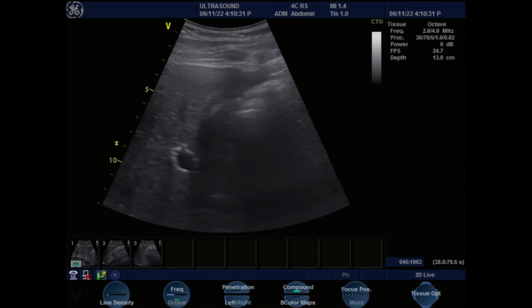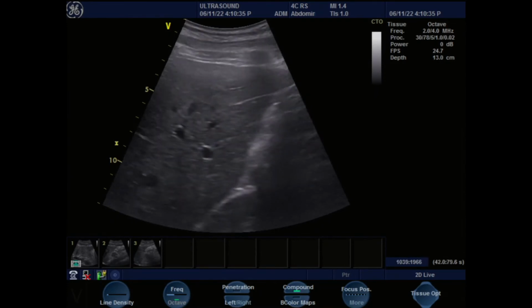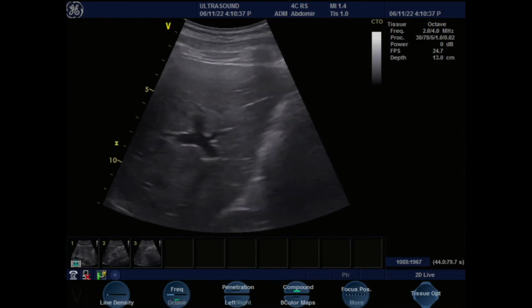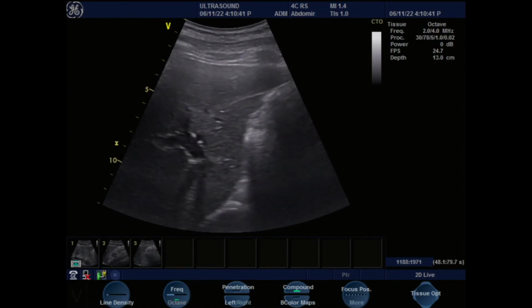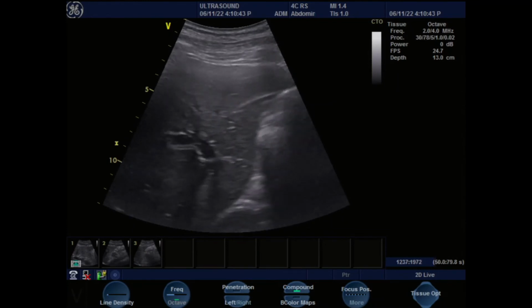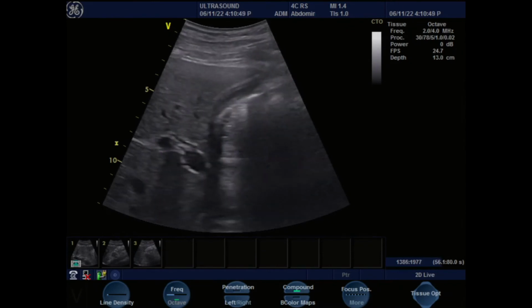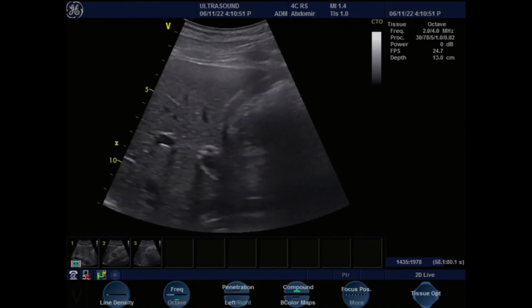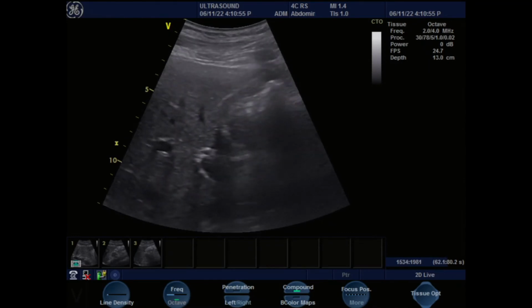Turn sagittal. We have to take sagittal and transverse images, but the probe doesn't have to be sagittal or transverse on the body. It has to be oriented to the gallbladder. So you can hold your probe oblique like this and still get a sagittal gallbladder. Because there's the gallbladder sagittal. You see it? Almost tapeworm looking.